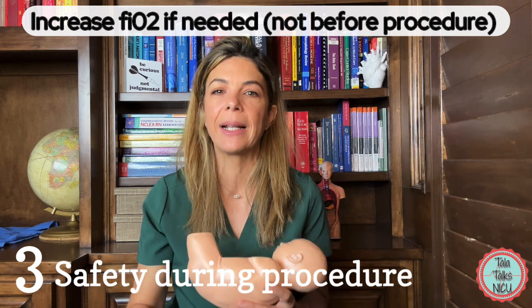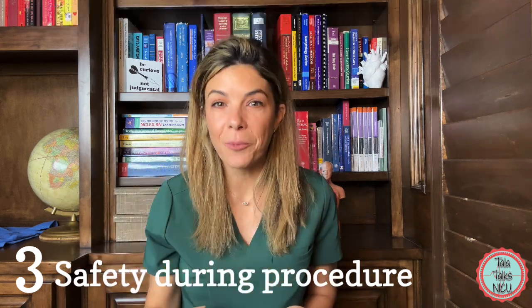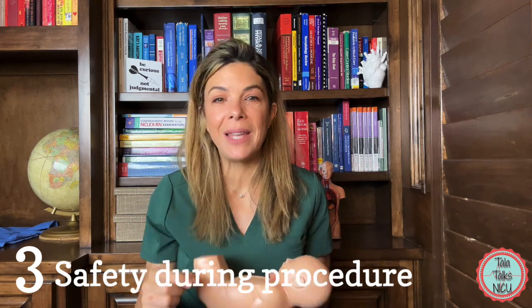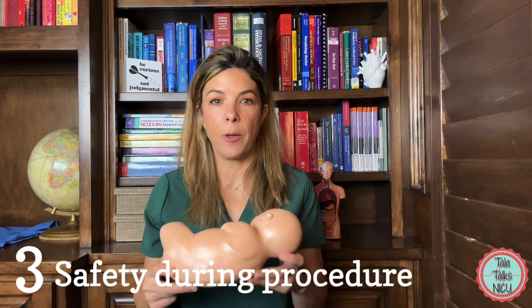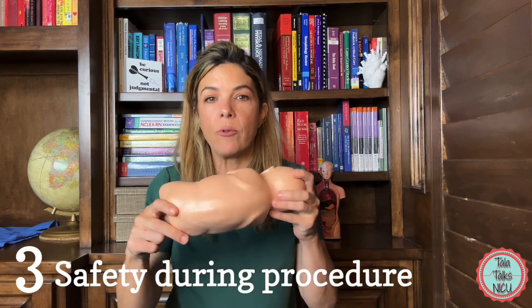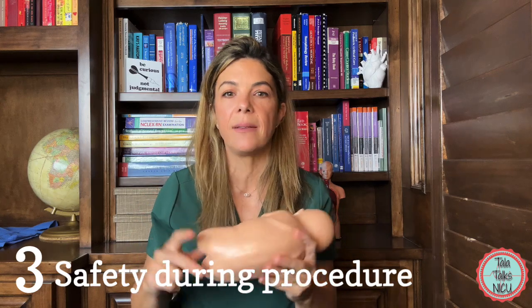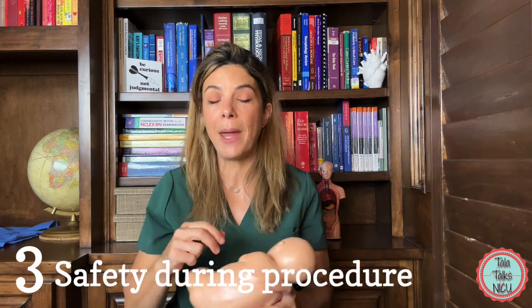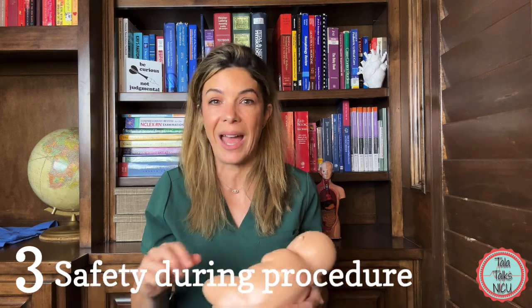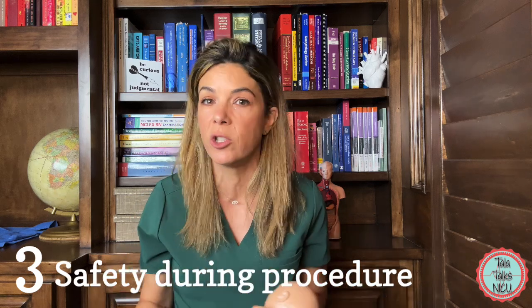Only increase FiO2 if the baby's sats are going down — don't do it automatically. Remember, the baby's safety is more important than getting the LP. If the baby is bradying or desatting, reposition the baby — straighten up the neck to bring the heart rate back up. Sometimes the baby just doesn't tolerate the procedure at all and we have to stop and make a plan for what to do in the future.